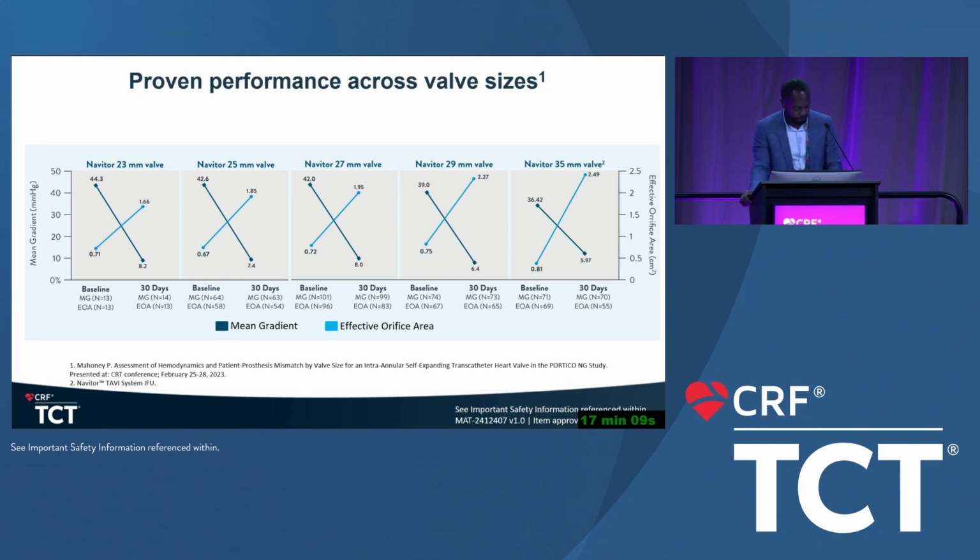Recently we had an STS valve course in Chicago, and when I organized that, we put 2 hours for hands-on on how to do valve root enlargement. I looked at all of the comments on that recently. The highest rated session for the entire 2-day meeting was that 2-hour hands-on. We limited it to about 75 surgeon participants because we wanted everybody to do hands-on, and we had about 30 hearts there.